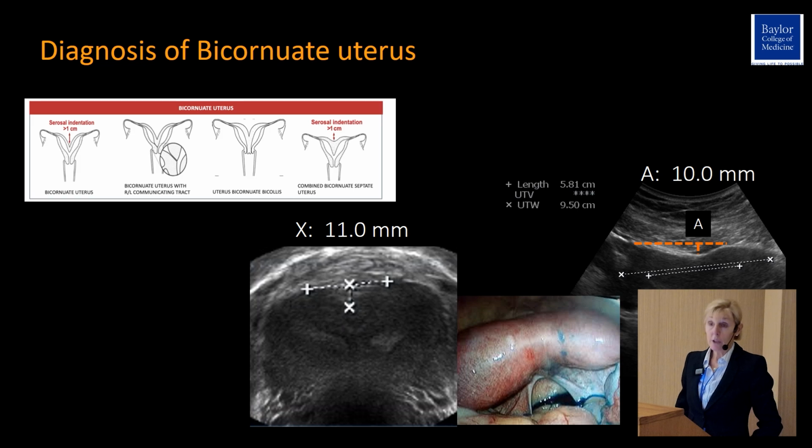If you see, a bicornuate uterus can also have subseptations, like in this case where you can see a septum. Whenever you have a septum in a bicornuate uterus, you want to incise the septum only, without touching the outer contour or the inner contour. So you just have to be very careful whenever you resect that septum.